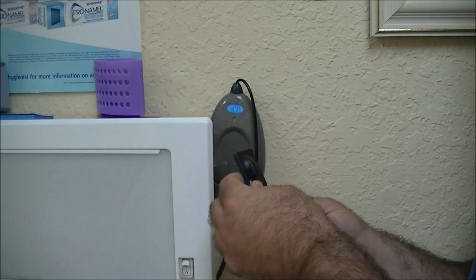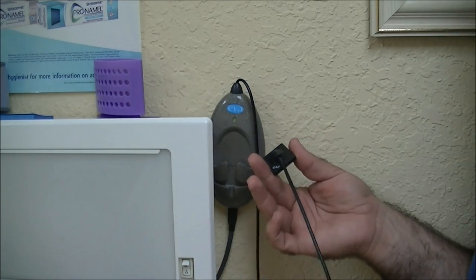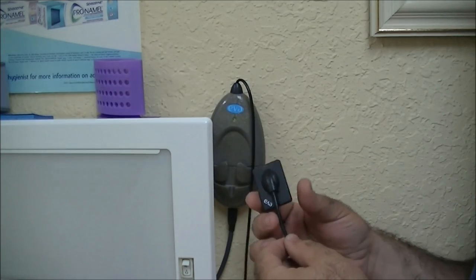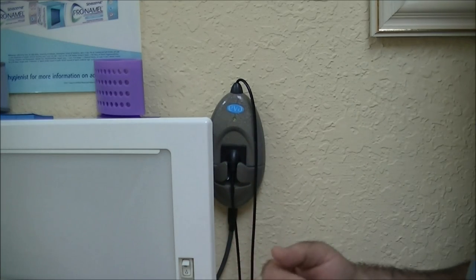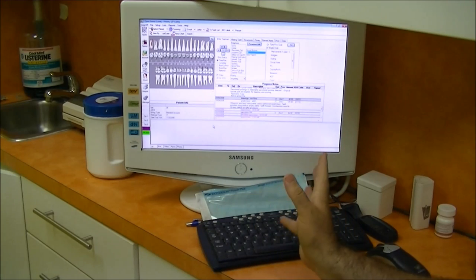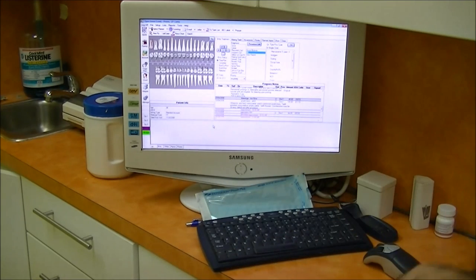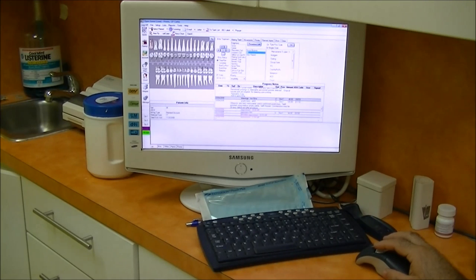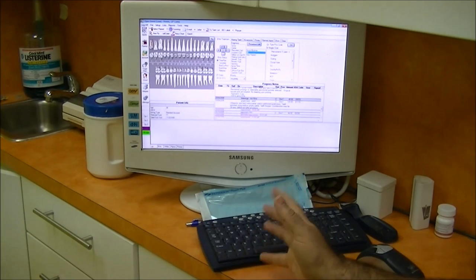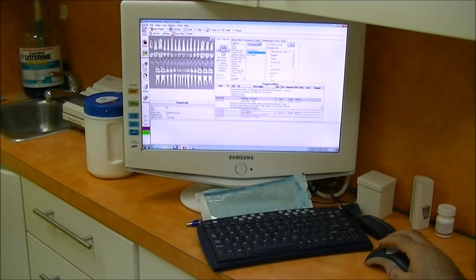Once it wears out — because people tend to chew on the cable — they just have to replace that piece, but it is very durable. Now here are some examples on the computer. This is my own record, so no one else is affected. I did get permission — it is my record. As you can tell, I have wonderful teeth. The digitizing of the dentist's office has been a wonderful advancement.